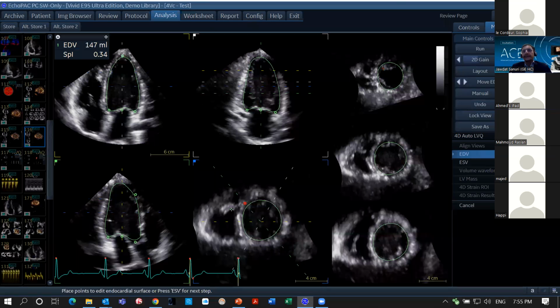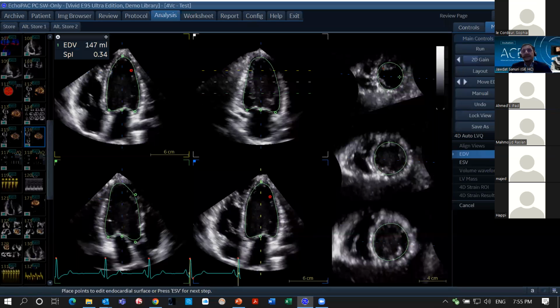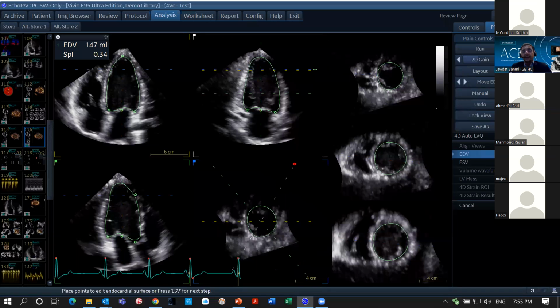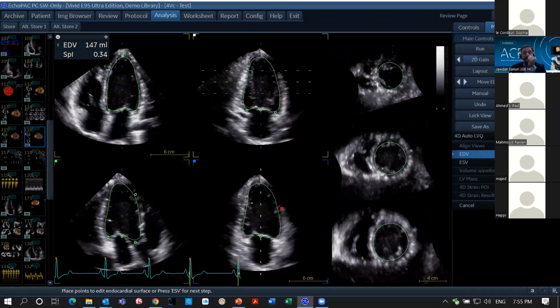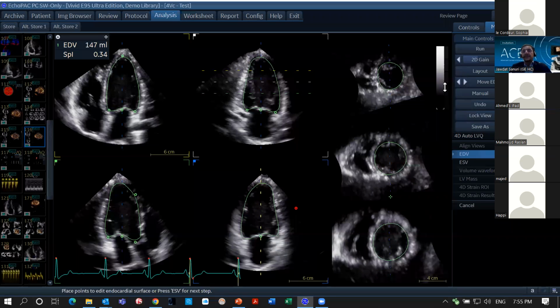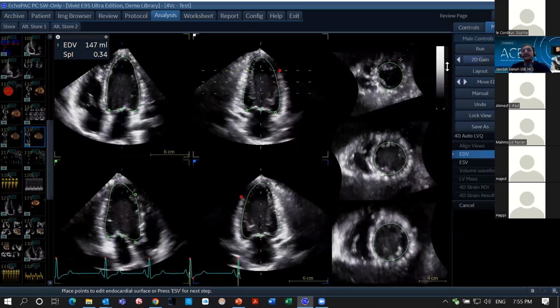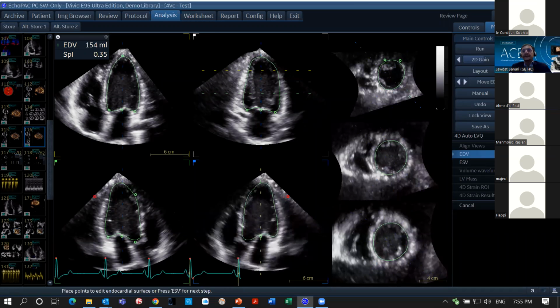Okay, so I included that, and you can check also the short axis views. What are these short axis views? You have the top one, which is a short axis at this yellow level. You have the middle one, which is short axis at the white dotted line level, and you have the bottom one, which is at the green dotted line. The important thing is that I can see all this trabeculation in the short axis. So again, I can go to the most compacted endocardium in each one of these short axis levels.